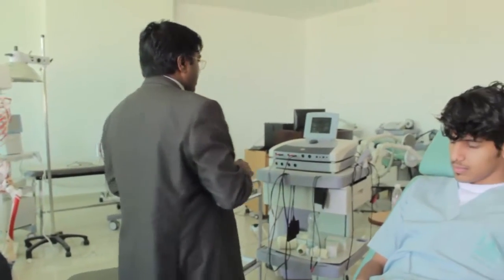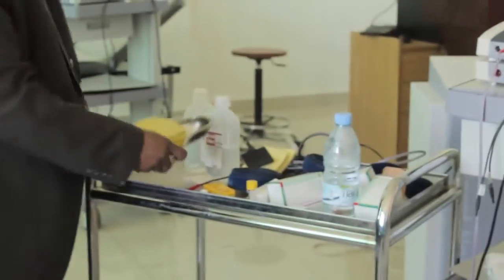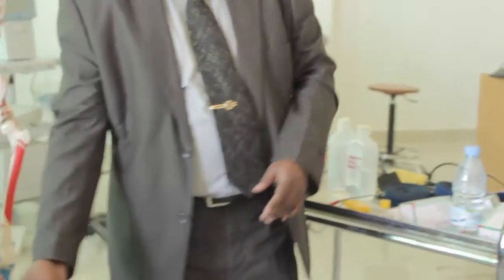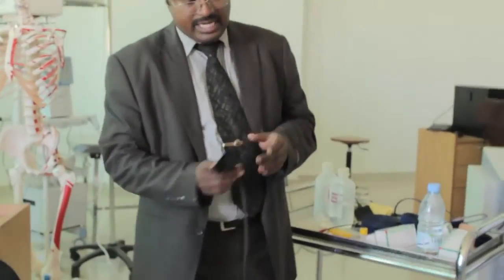What materials you require for high voltage pulsed galvanic stimulation is definitely the machine, and you need water and the electrical pads, straps, leads for electrical stimulation, some water or gel, whatever is available. Towels too. These are the things usually required for stimulating the patient with high voltage pulsed galvanic current.